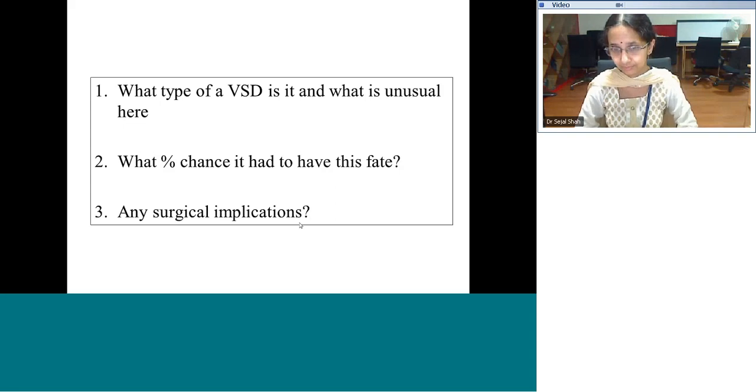It will never close spontaneously. Okay. I actually am not very sure, but I understand what you're trying to say.